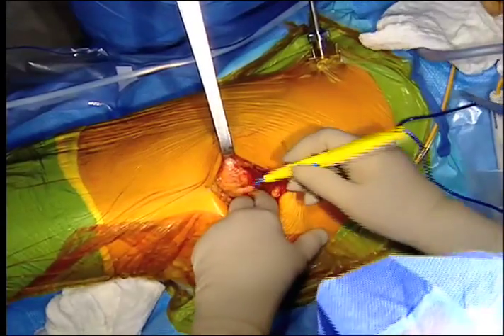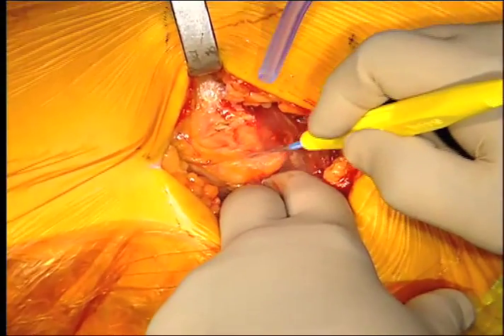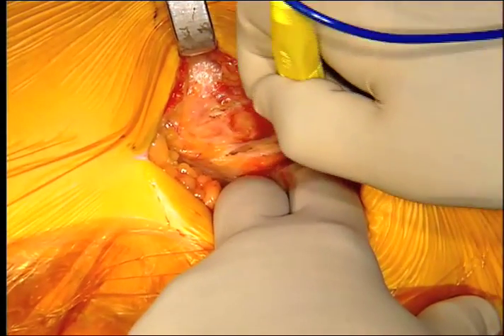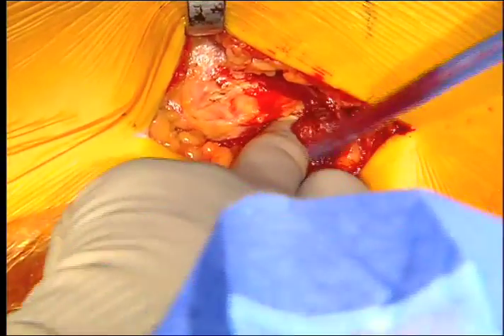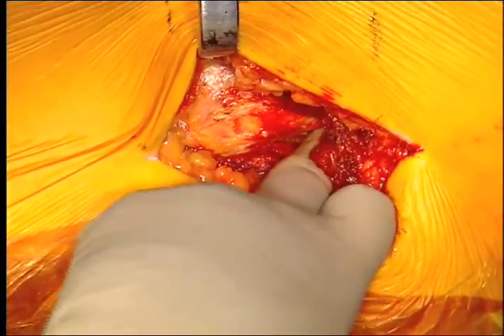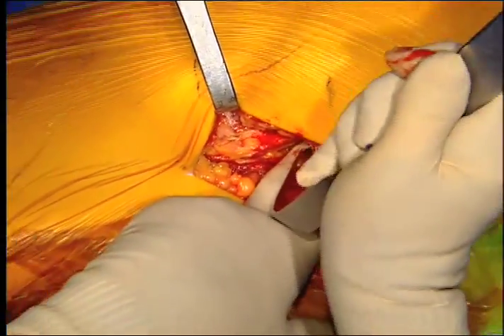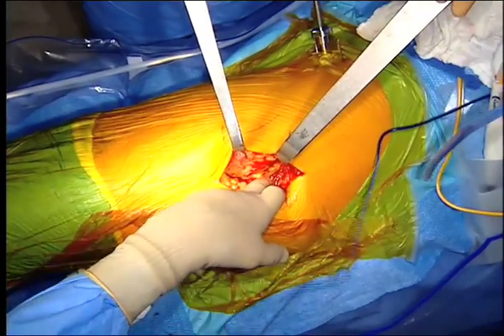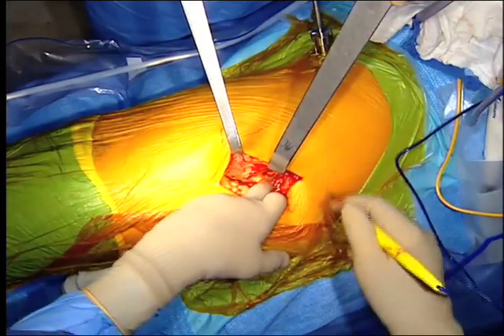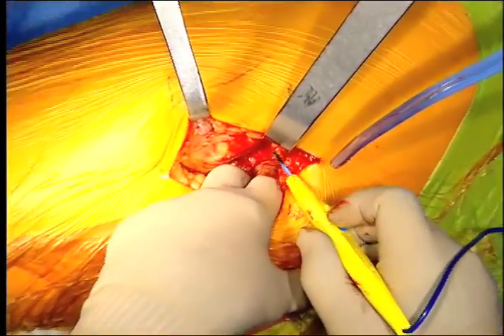We divide the gluteus maximus — I usually do that with the bovie, though it can just be split. Then we divide the fat over the back of the greater trochanter. I feel over the top of piriformis. You can see we have long-handled retractors, which makes it easy for the assistant, and you can see the fat in the back of the greater trochanter.